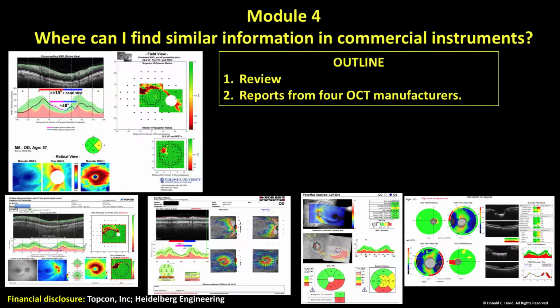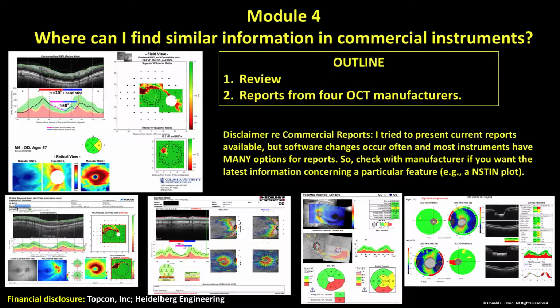Welcome back. This is Module 4, and what I'd like to do in this lecture is answer the question, where can I find similar information in commercial instruments? So first a little bit of a review, and then we're going to go over the reports from 4 OCT manufacturers. A disclaimer about these reports.